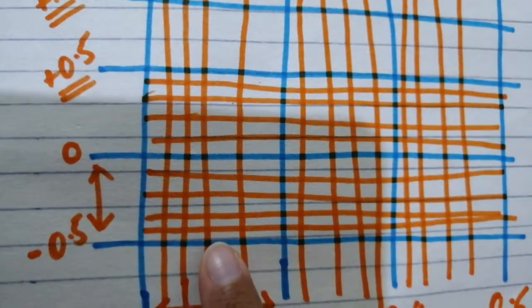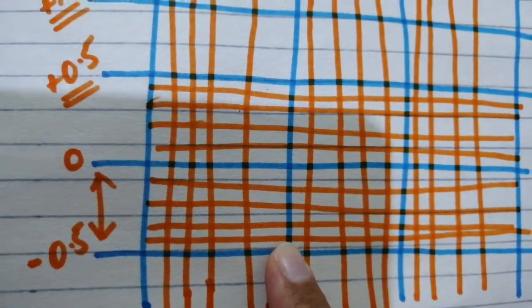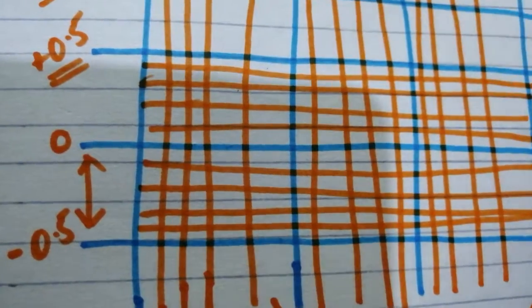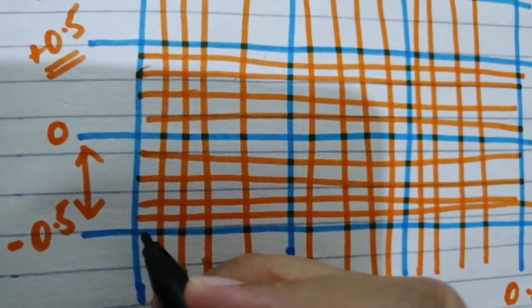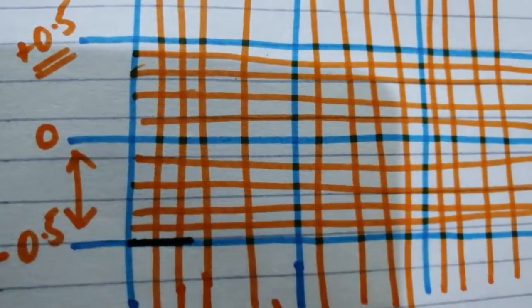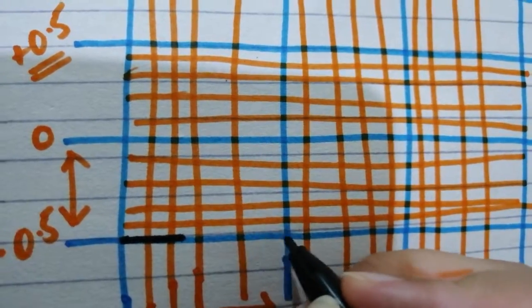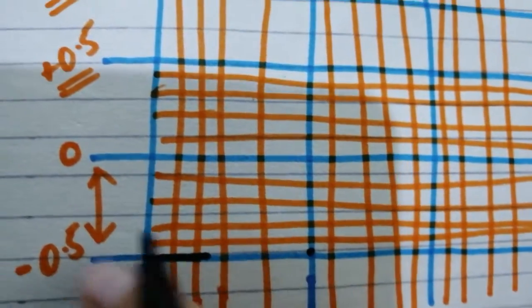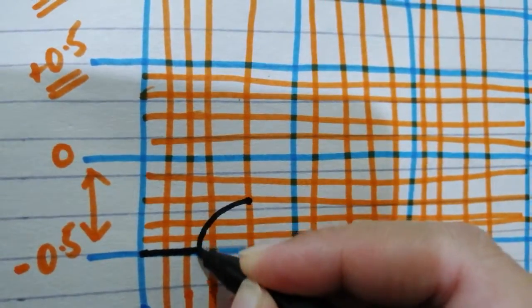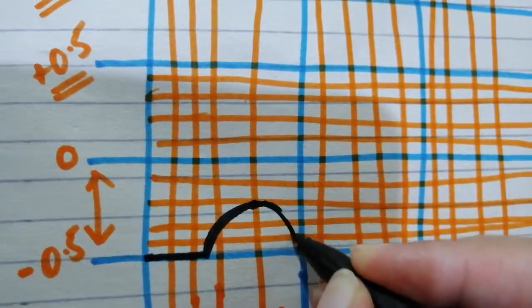And waves are basically deflections. So the first deflection that tends to appear is the P wave. And P wave, how much duration does a P wave have? It is about 0.1 seconds, which is 1/2 of a big square, so 2.5. So if we do this, right, and this is it, and the amplitude tends to be 0.1 to 0.3.